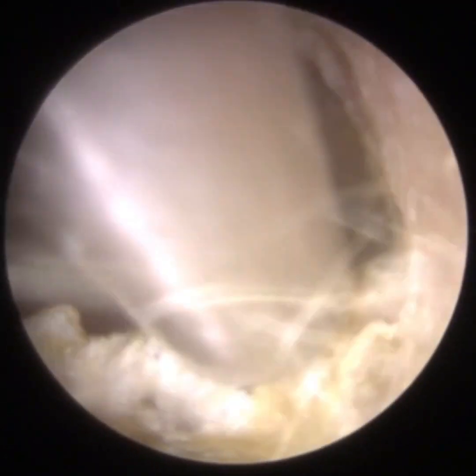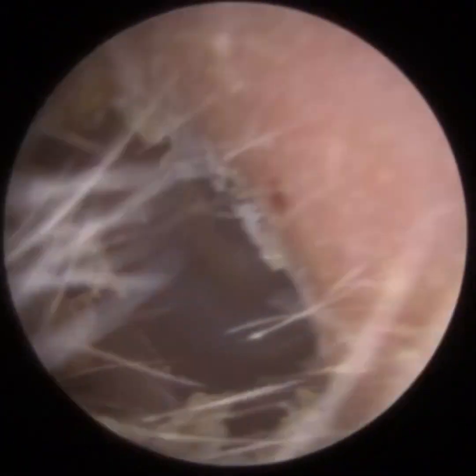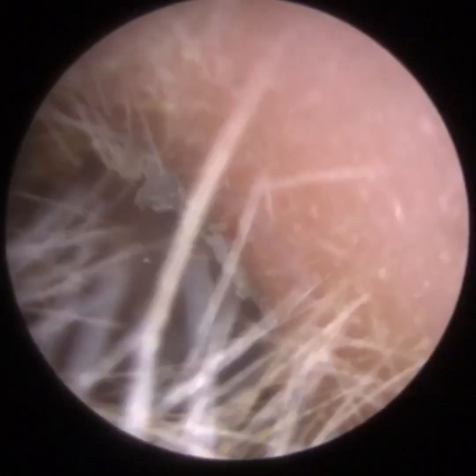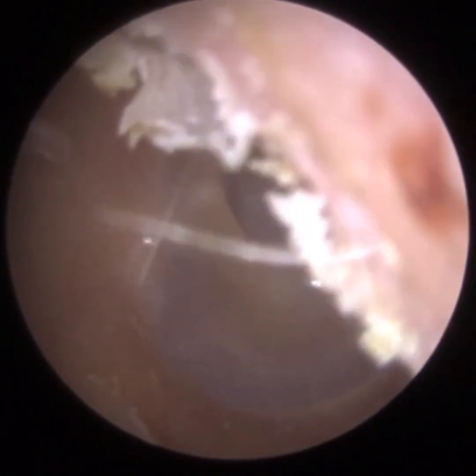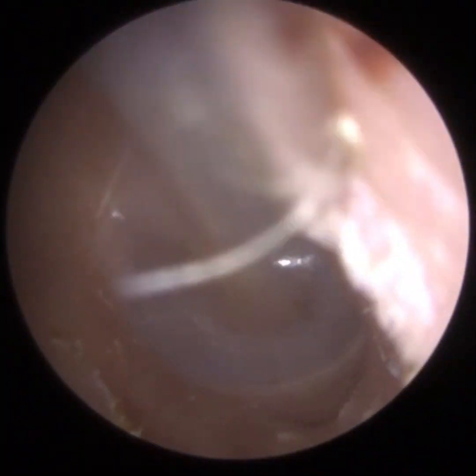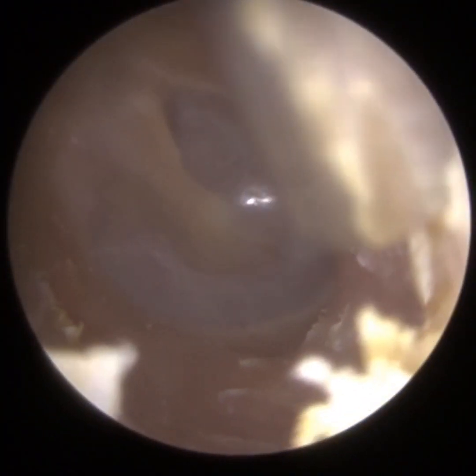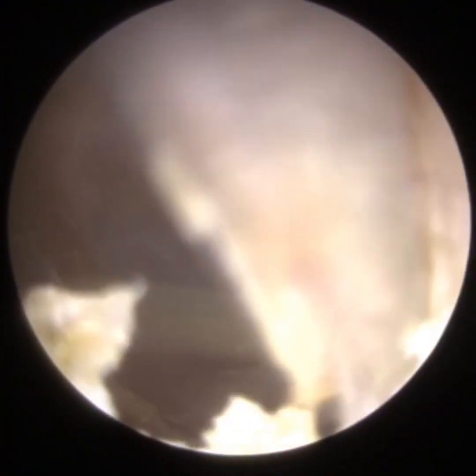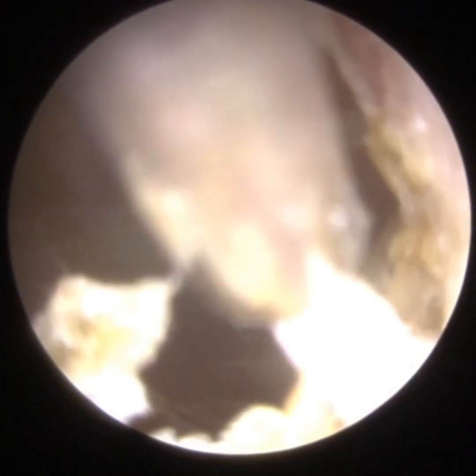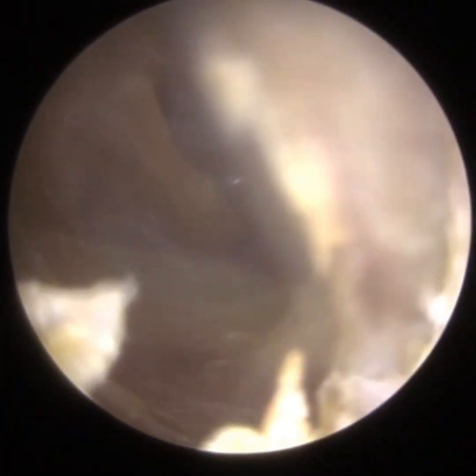And in the case of this patient, I decided to remove it because the skin is not going to come out by itself. She has got a bit of otitis externa. You can see that's just scratching at the entrance just here on the right-hand side, and that's because of the dry skin. So by peeling this dead skin, it's going to help the patient.